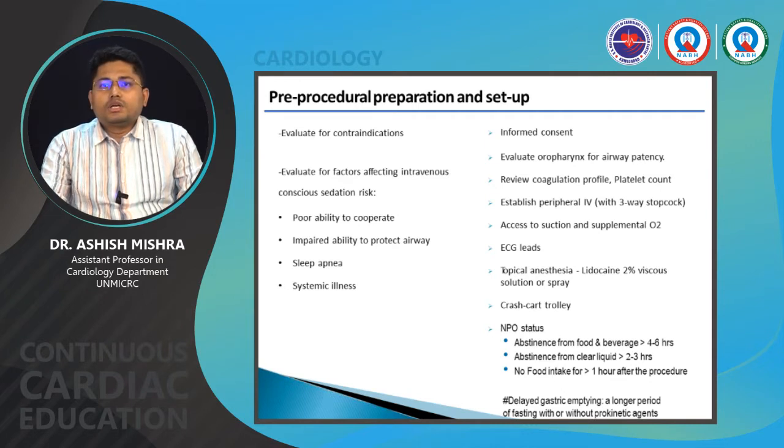Topical anesthesia, particularly 2% viscous solution or lignocaine spray, can be utilized for local anesthesia. Then a crash cart trolley should be available at hand's side. Then NPO status should be confirmed, particularly at least 4 to 6 hours of abstinence from food and beverages is necessitated.